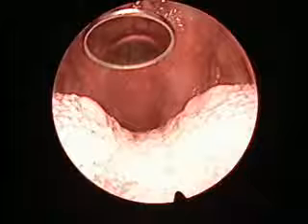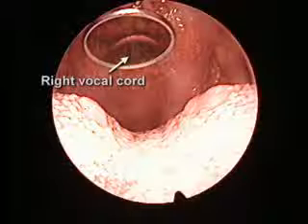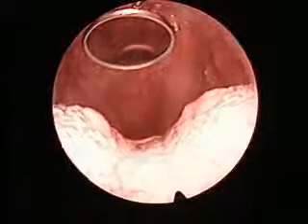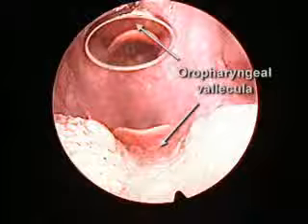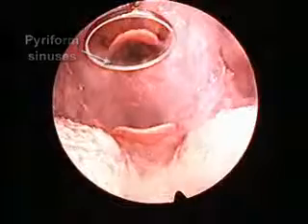With mirror laryngoscopy, the image is inverted. In other words, the right vocal cord appears on the left side of the examiner's view on the mirror, and vice versa. The anterior aspect of the larynx can be seen by asking the patient to say E in an even higher register. This fully visualizes the anterior commissure. The oropharyngeal vallecula and the piriform sinuses in the hypopharynx are also visualized and should be inspected for symmetry.